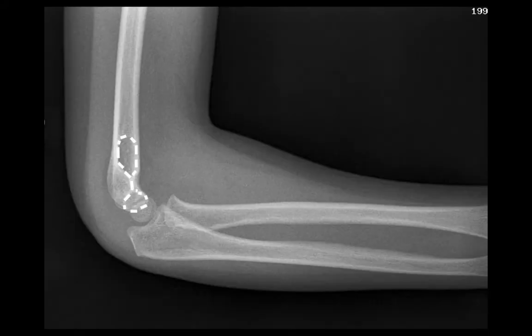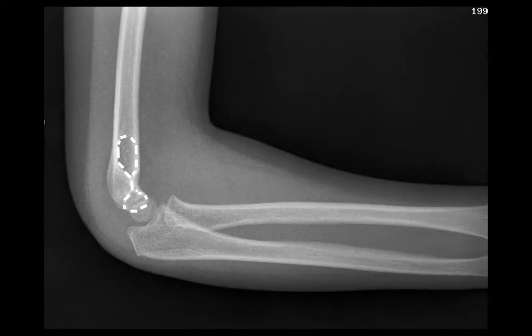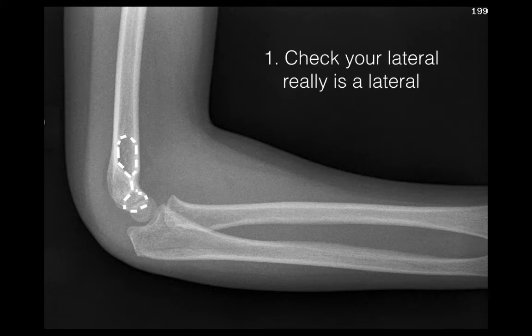The second view that we obtain is a lateral, and that dashed line forming a figure of 8 in the distal humerus is the so-called hourglass sign. This tells us that the lateral film is a true lateral and it's the first step in assessing the elbow. If you don't see that hourglass sign, that figure of 8, then you need to get a repeat lateral film, otherwise you can't properly assess the alignment of the bones that make up the elbow.